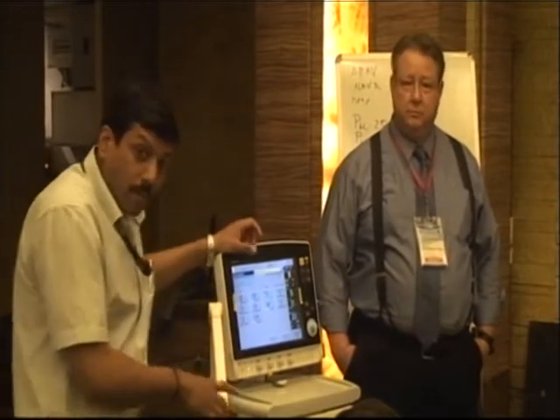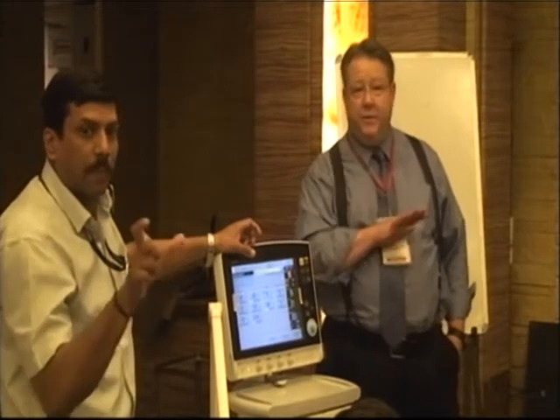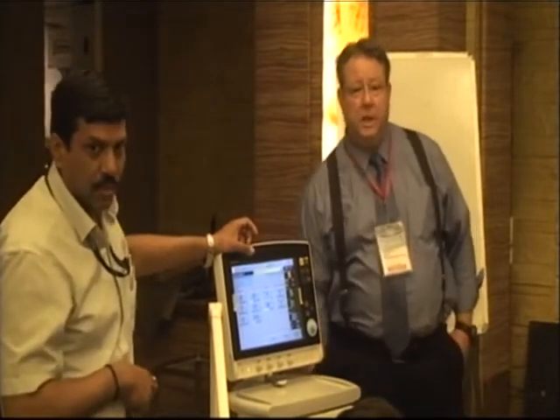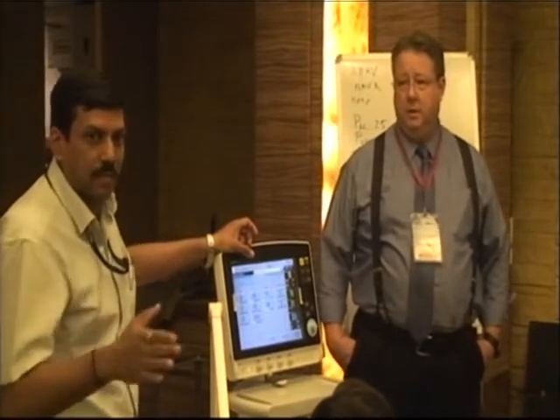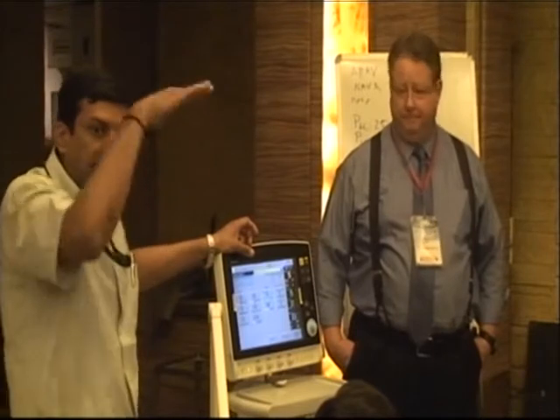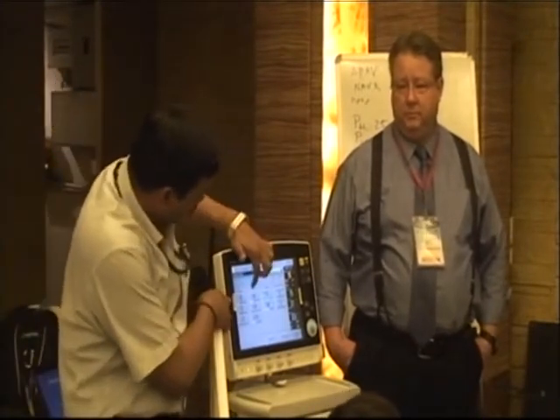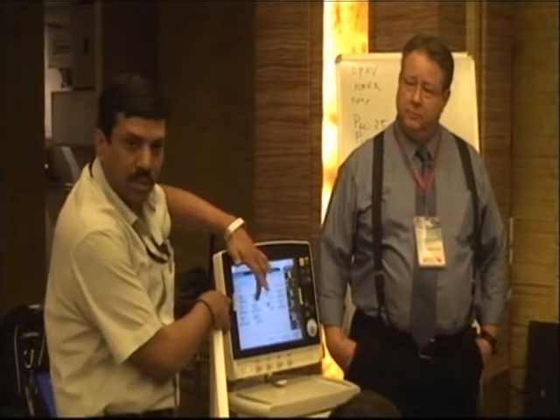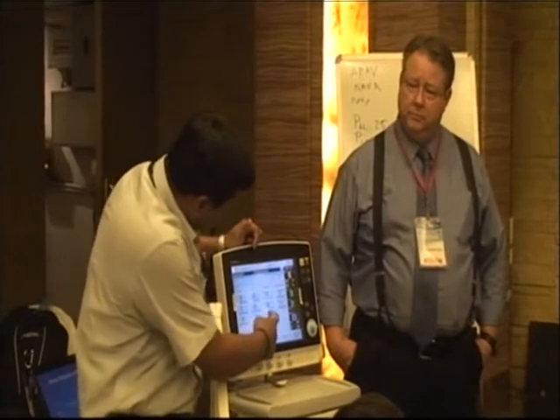The I time is more than the expiratory time. Yes, this is definitely inverse ratio ventilation. It's on purpose. But in inverse ratio ventilation, you have to sedate and paralyze the patient. In APRV mode, you don't have to sedate and paralyze. The patient can breathe on both CPAP levels. So we have the time for T high of 3.5 seconds and the time for low CPAP, that is T low, of 0.5 seconds. Then we set the inspiratory cycle.